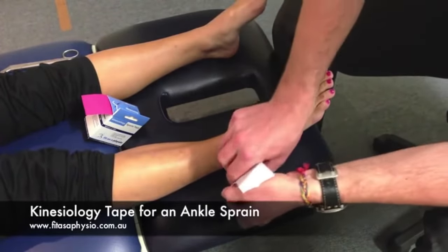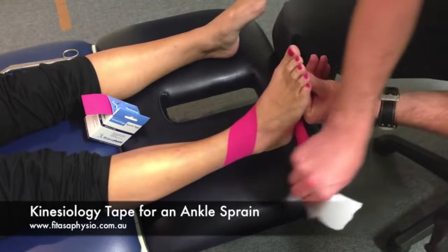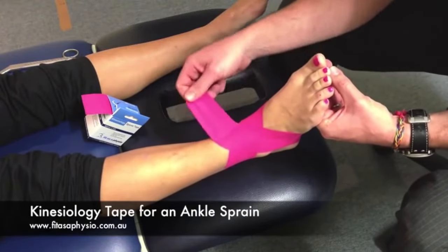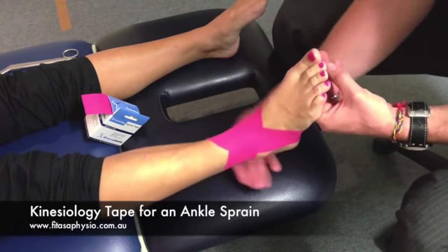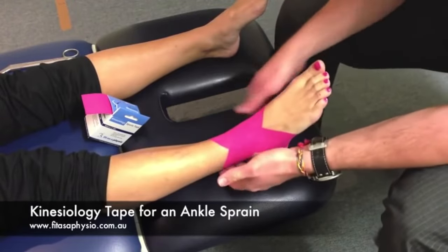This side is the more important one. I'm going to hold her foot in plantar grade at 90 degrees, and this side is the more important one, covering those lateral ligaments. And a couple of inches of no stretch at the top of the tape just to help. I rub it on well to activate the glue — warm it up so it sticks well.